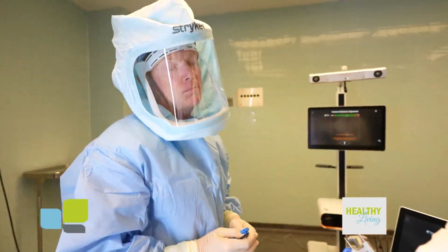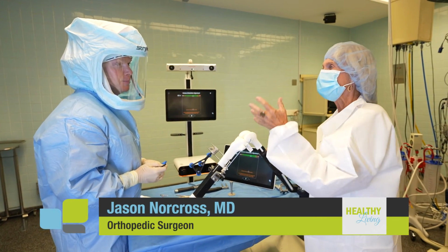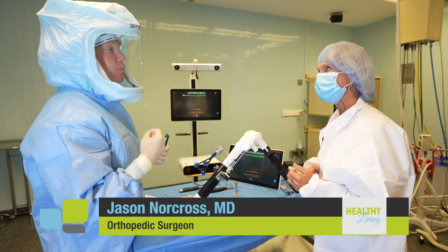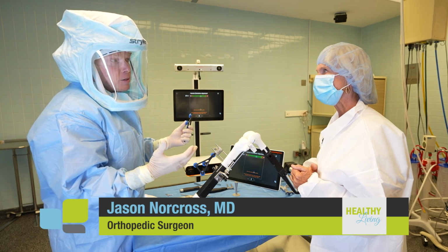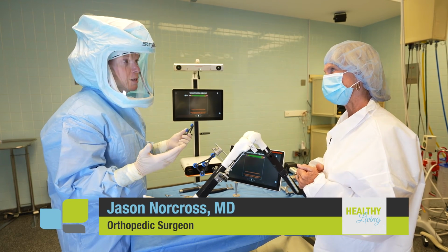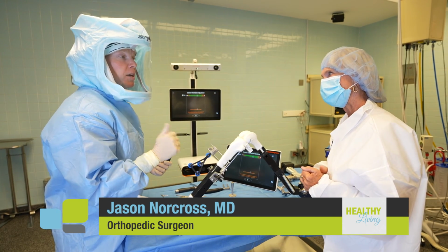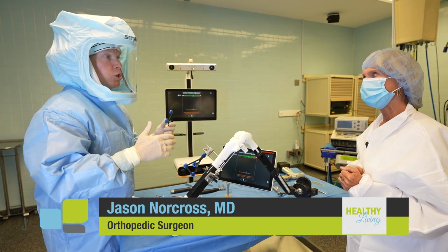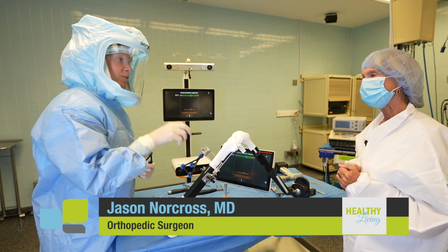And what was interesting when we chatted a little bit before was in the old days, does your knee turn in? Does it turn out? You said anatomically, everyone's knee is created differently. That is absolutely the truth. In fact, every knee surgery I perform is different and unique for that individual patient. So conventional instruments that have historically been used to perform knee replacement surgery are one size fits all. This is custom. Every operation is custom. It's customized to the individual patient's anatomy and their deformity and their soft tissue balance and their uniqueness. And so I perform custom surgery on each and every single knee I do.